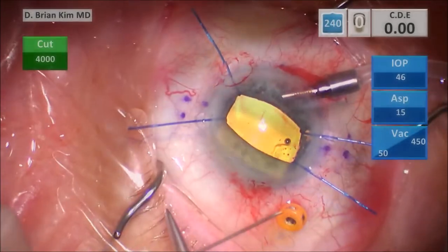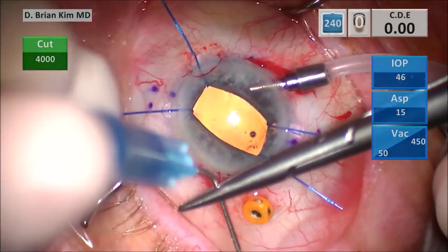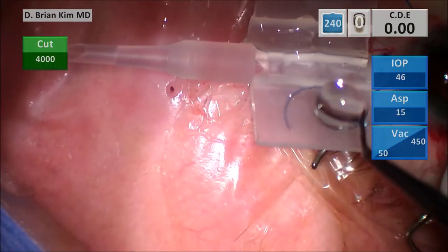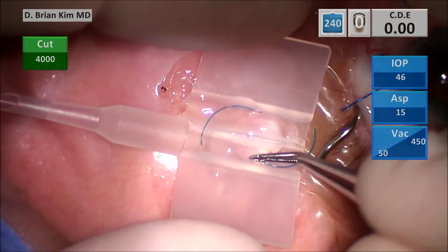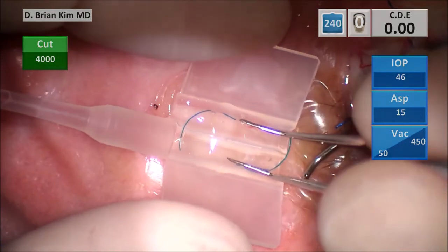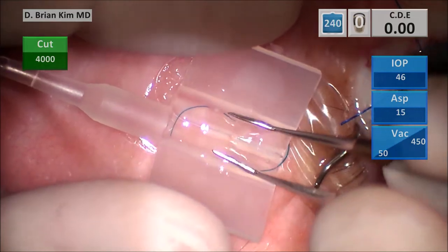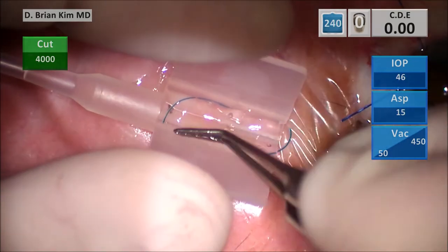This is the left-side needle, and this is the 25-gauge needle that's going to be used to externalize the leading haptic — the bevel is facing to the right. This is the Sensar lens; I have the cartridge there, use some forceps to hold the haptic gently. The cartridge has already been filled with viscoelastic and some BSS, and you want to make sure it's seated down into the cartridge. The haptics need to be seated down as well, because as you fold it down you should see the leading haptic is coming out straight and entering into the barrel, and the trailing haptic should be sticking out at the end. Make sure the haptics are not kinked as you fold the cartridge closed.